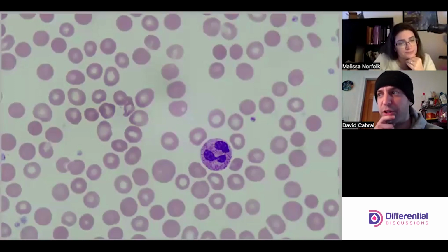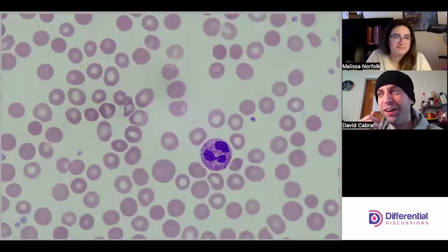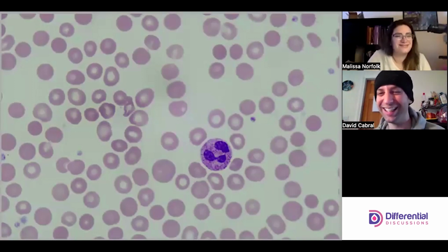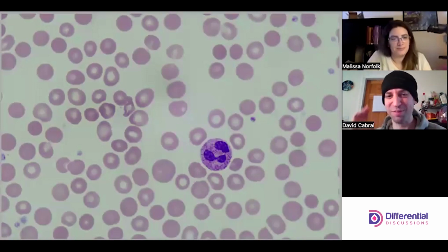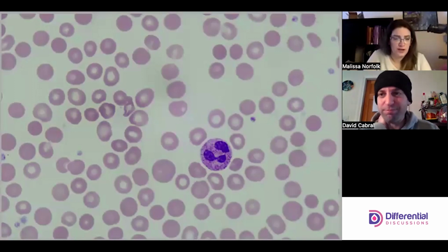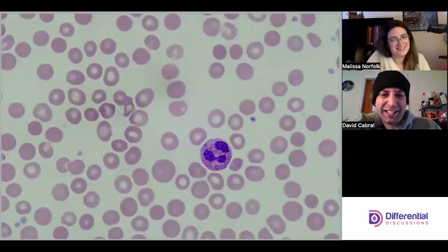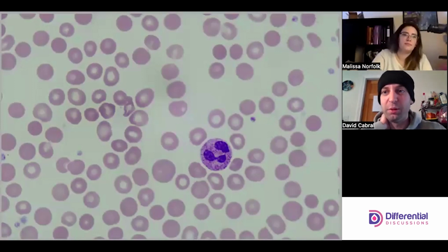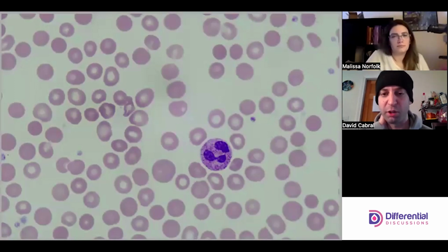Most often you'd notice this when the oncology clinic calls and asks, "Hey, what's the ANC on so and so?" And you start looking, reviewing that right now, and you see toxic granulation and Döhle bodies. So it's your chemo patients, trying to push up their neutrophil count so that they can go home. This is a pretty good example of the sort of toxic granulation you may see with patients that have been recently given this therapy.